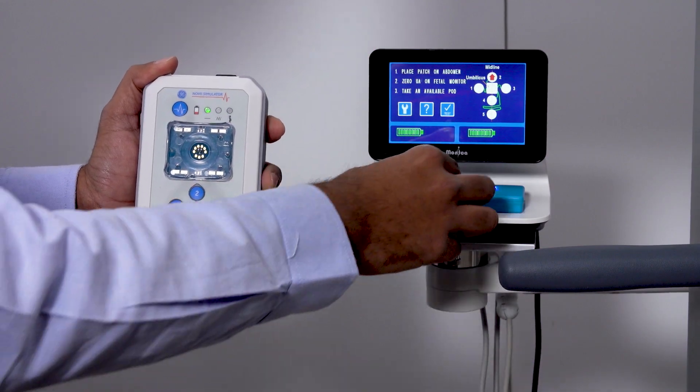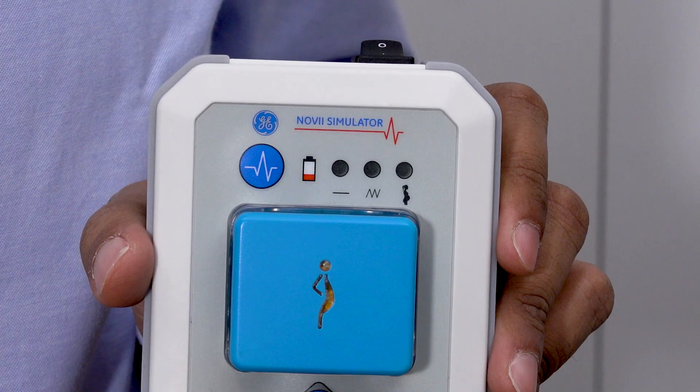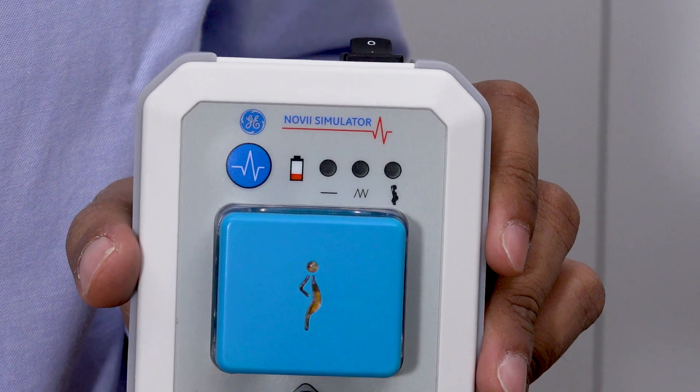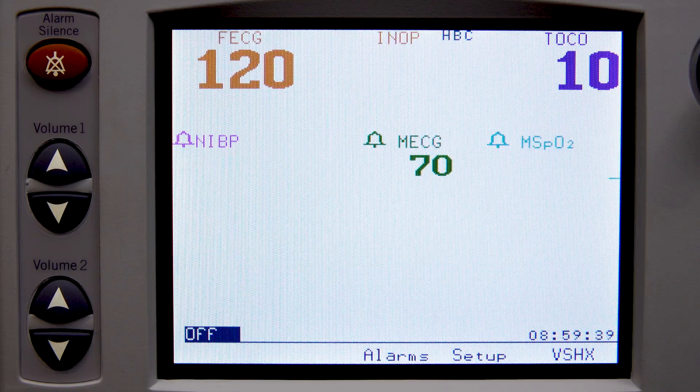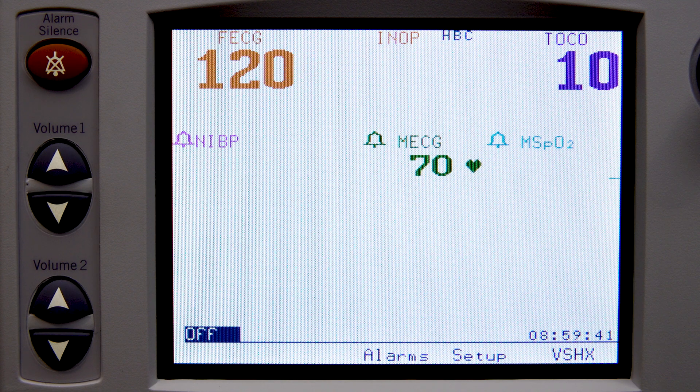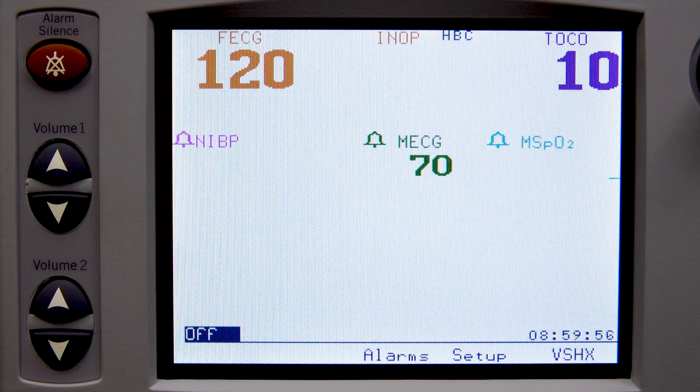The Novi simulator lets you simulate in three different modes. Constant mode, which is also the default mode, lets you simulate maternal heart rate, fetal heart rate, and uterine activity signals at constant values, which is a maternal heart rate of 70 plus or minus 3 beats per minute, fetal heart rate of 120 plus or minus 3 beats per minute, and uterine activity of 0 to 50, plus or minus 10.